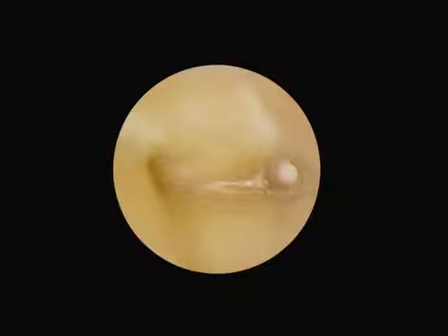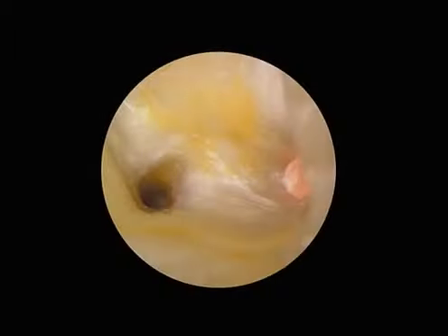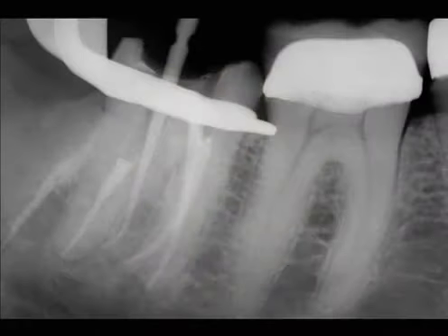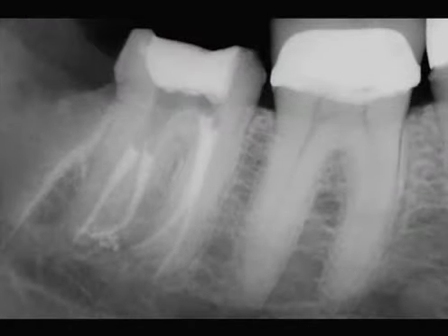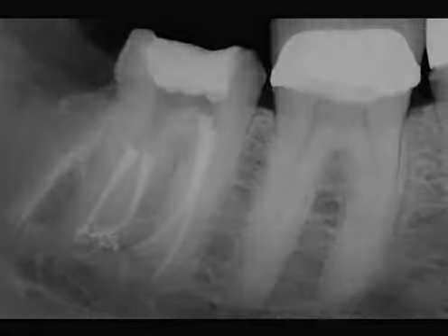Notice the white line between the treated DB and DL orifices. The photograph at 15 power shows access to a shaped distal lingual system, a cleaned out isthmus, and the previously treated DB system. A working film shows a size medium master cone at length. The post-treatment radiograph demonstrates the packed DL root canal system.